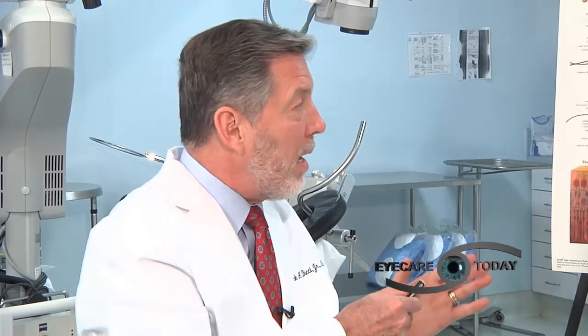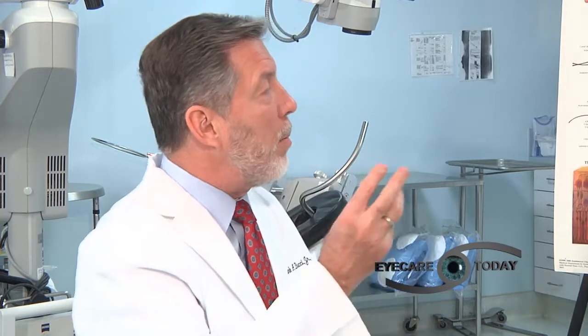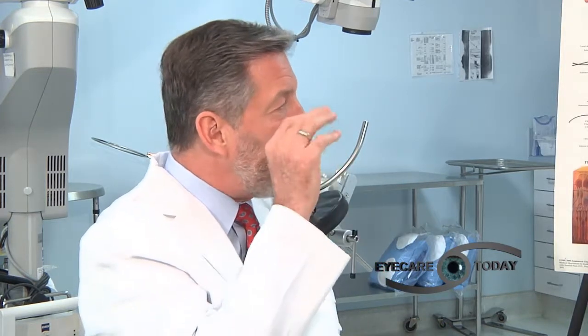Okay, so for cataract surgery, when we go inside the eye, the eye is numbed with no needles, no stitches, no patches. Just with eye drops, eye gel. The drops numb it, and then we give the patient some extra sedation. I always tell them if you had no sedation, your eyes still wouldn't have any pain anyway, but it allows them to relax. So now it's no needle, no stitch, no patch, no pain.